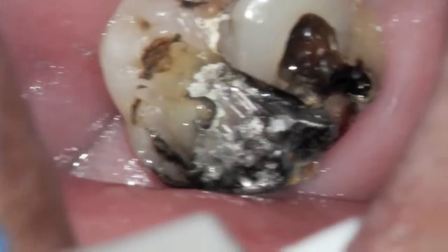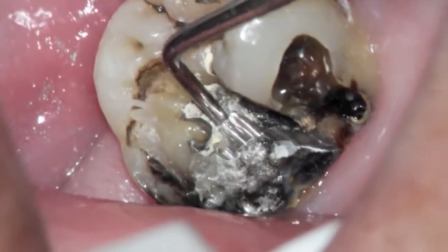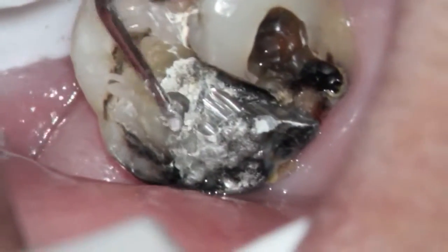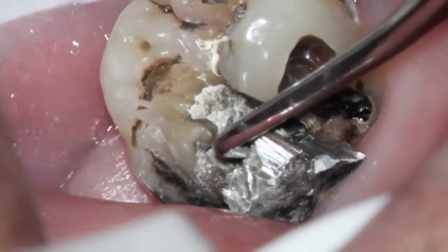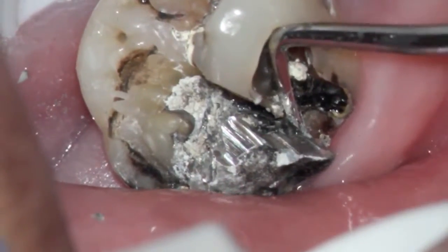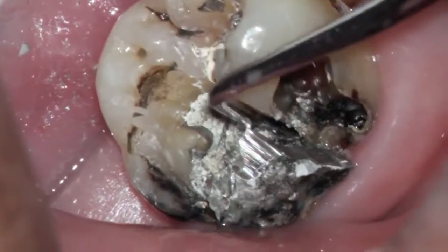Most of the silver filling material is out. You can see the silver right there that's moving, and that's because there is the pin that is holding it in place. This is truly a huge filling for the person. When it was originally done, they should have probably had it crowned or some other more enduring restoration, but she just could not afford it, and this was the best that could be done at that time.